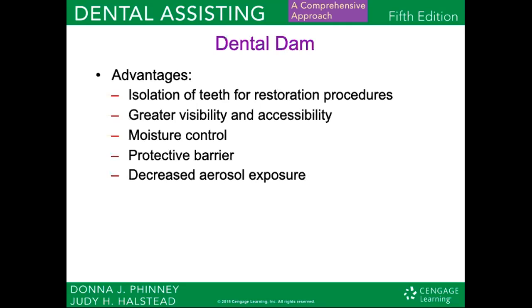So talking about dental dams now. A dental dam can be used during restorative procedures to isolate the teeth required for restoration. The dental dam allows for greater visibility and moisture control, and it also serves as a protective barrier, preventing the aspiration of restorative materials by the patient. So we don't want patients choking or swallowing things that we're trying to use in their mouth. And so a dental dam is one of the things that can be used to prevent that.